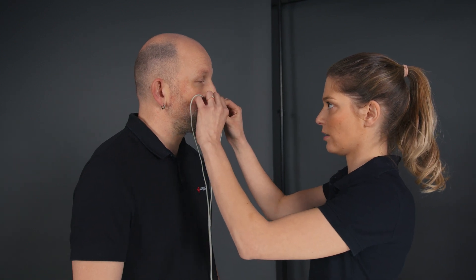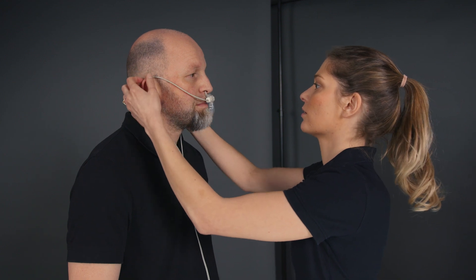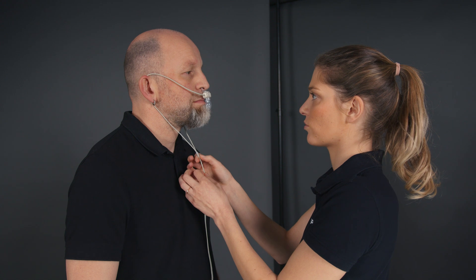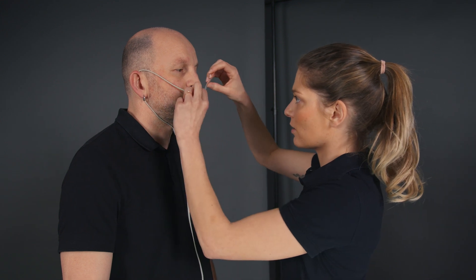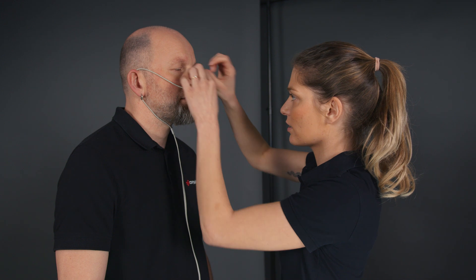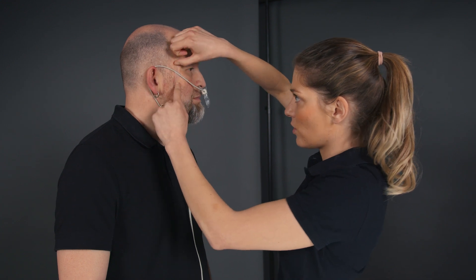Don't panic Ben. Two small plastic tubes will be placed inside your nose and now I will put the cables behind your ears. I'll align it in the middle and fix it in place with the slide. Is that too tight or is it okay? It's okay. Very good. Then I will fix the whole thing in place. I have prepared some tape already. I'll put a piece over the adapter on your nose and pieces on your left and right cheeks over the cables. Now it all sits firmly and won't slip.